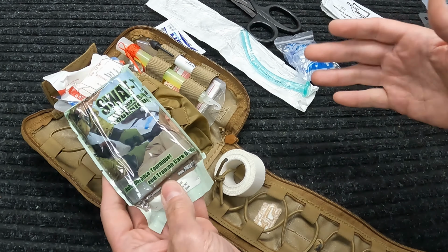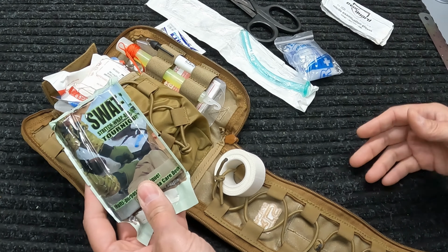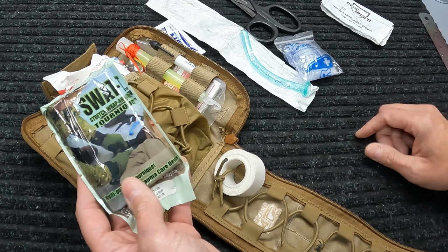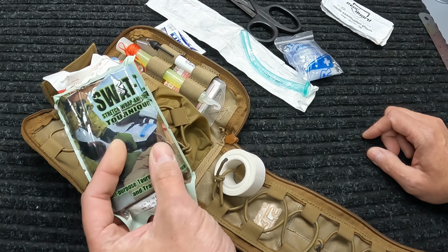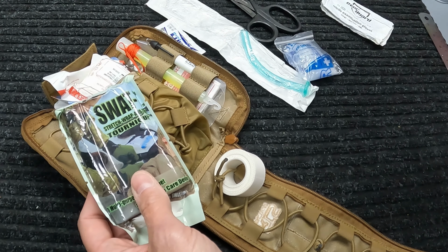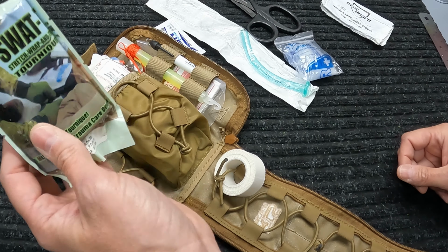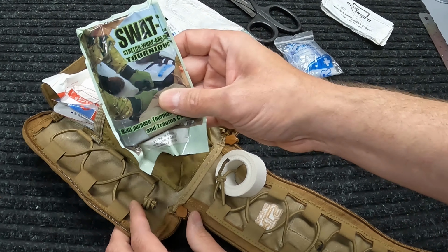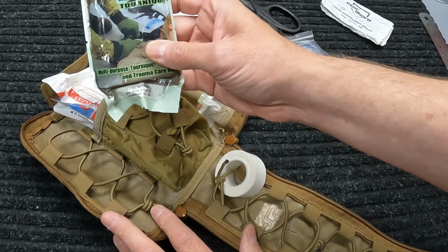But all that being said, like I said, you can opt to upgrade to an additional CAT tourniquet, or they have the SOFT-T type tourniquet too. So it's basically kind of personal preference. Like I say, this one has a multitude of uses. The CAT-T is going to be easier to apply to yourself, so it wouldn't hurt to have both, to be honest with you. But as for the basic setup, it comes with this SWAT-T multi-use tourniquet.